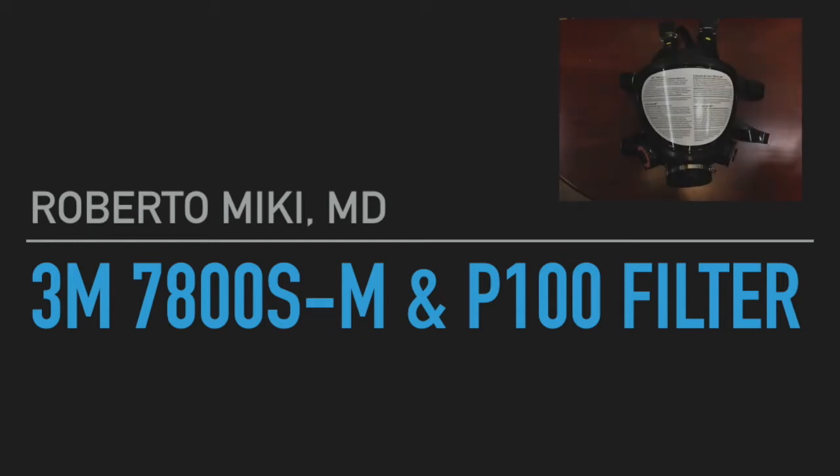Hi, it's Roberto Mickey again and we're going to be showing some data on a new mask, a 3M 7800S-M full face mask respirator.